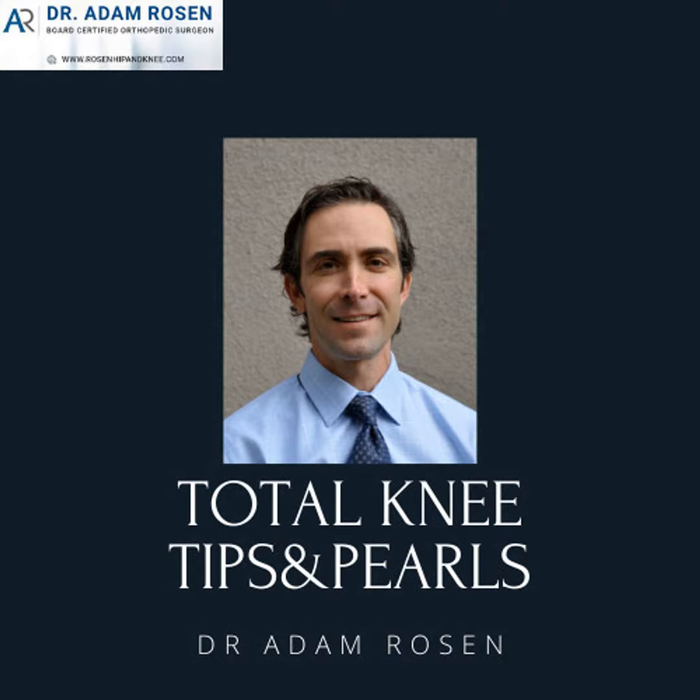On the hip, it's similar. If we're looking at the hip x-ray, again, you've gone through describing the views and the soft tissue and skeletal immaturity, but is it a good AP? Is there pelvic tilt? What is the appearance of the visualized segments of the lower lumbar spine? Can you see degenerative disc disease? Can you see a scoliosis? Do they have acetabular dysplasia? Do they have a protrusio? If you do have a good AP, you might be able to comment on what the version is.